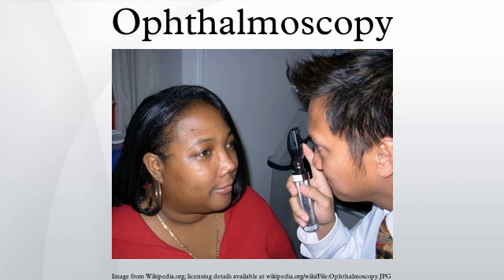In 1915, Francis A. Welch and William Noah Allen invented the world's first handheld direct illuminating ophthalmoscope, precursor to the device now used by clinicians around the world. This refinement and updating of von Helmholtz's invention enabled ophthalmoscopy to become one of the most ubiquitous medical screening techniques in the world today. The company Welch Allen started as a result of this invention.